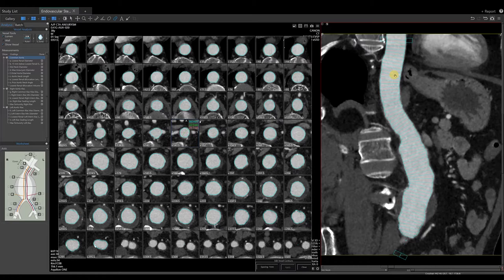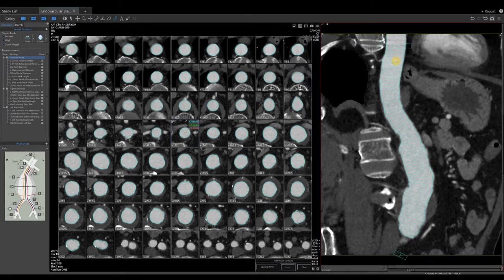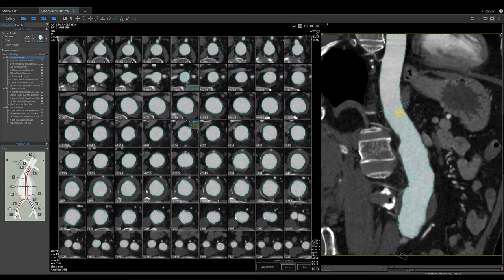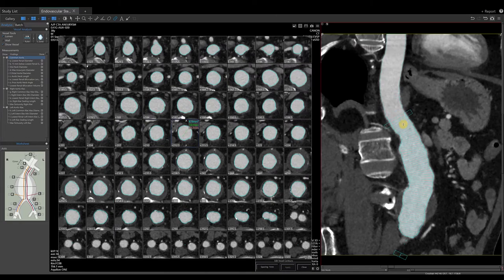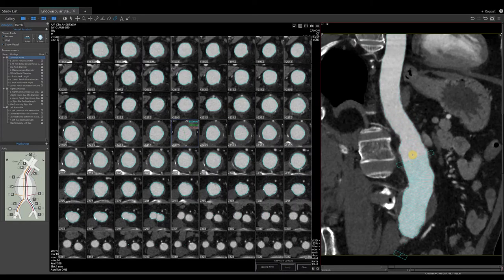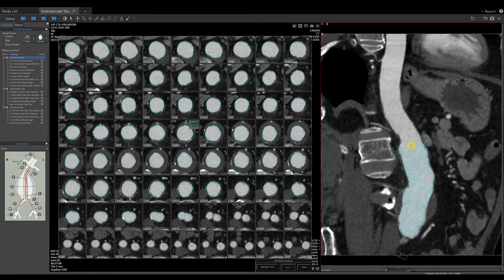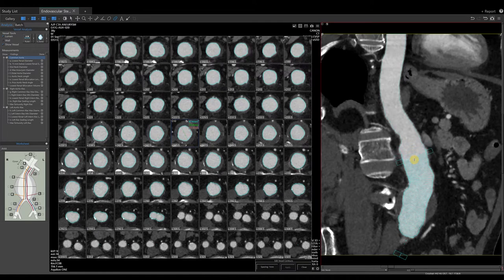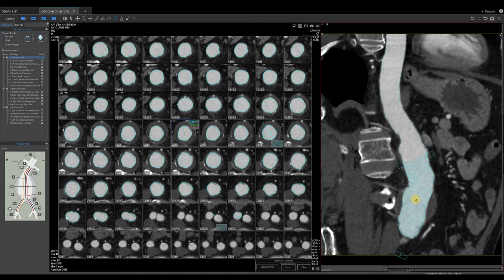Each line represents a cross-axial slice to the left of the CPR image. By default, the spacing between slices is around 5 millimeters thick. To change the spacing, grab one end of the worm-like object or the other, left-click, and drag. Dragging towards the other end will decrease the slice thickness. Dragging away will increase the slice thickness. To move the entire worm-like object or contours, hover in the center, left-click, and drag.